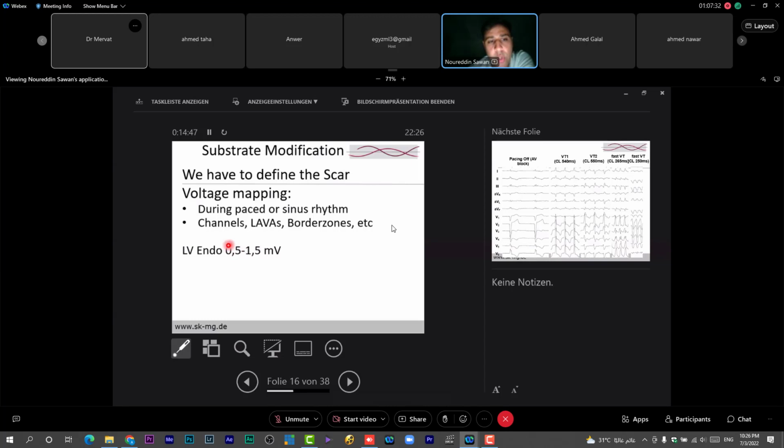They always advise the low border, but however in most cases this number is not that important. This number is very important: the high border. So generally, the high border is important.